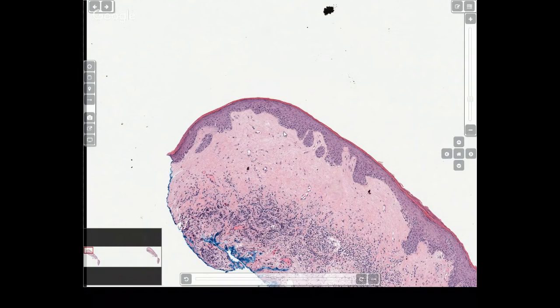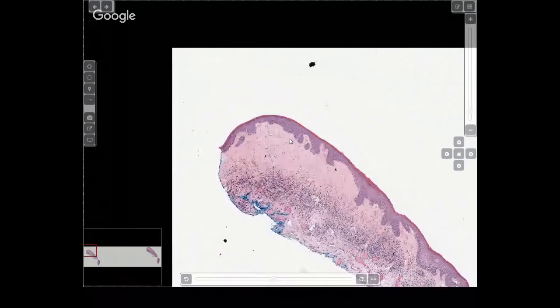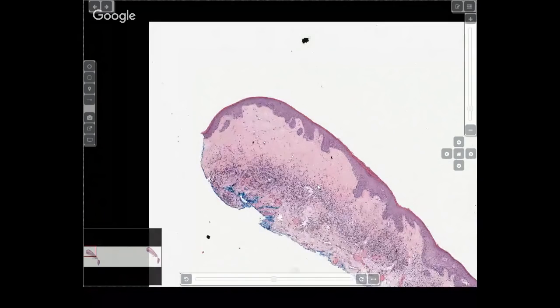And when the sclerosis tends to involve the lower part of the dermis, then you call it morphea. Many times lichen sclerosus and morphea can coexist because they are the same disease process. If it is just limited to the papillary dermis, you call it lichen sclerosus. If it is involving the deeper part of the dermis, it could be lichen sclerosus / morphea. But again, they have this lichenoid infiltrate at the dermal epidermal junction.